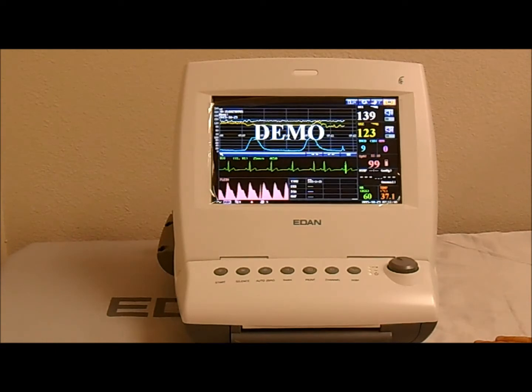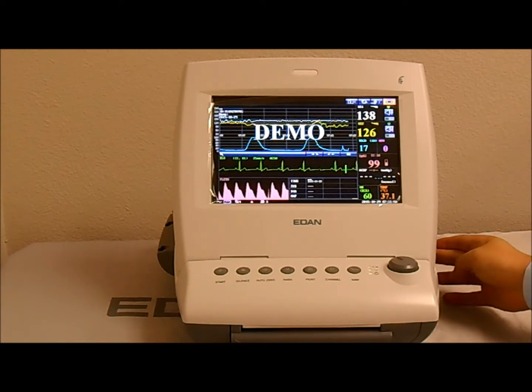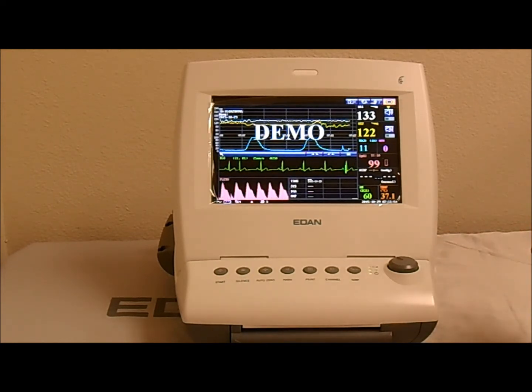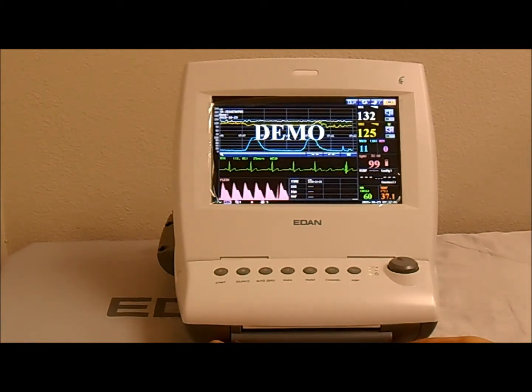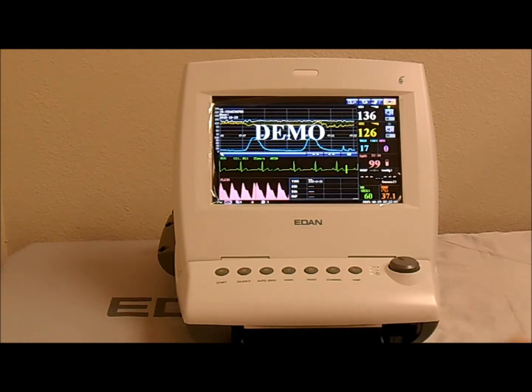Okay, now that we reviewed the different accessories and sensors that are included, let's move on to the operation of the monitor. To power the monitor on or off, you'll find there's a power switch on the right side of the case. After turning on the monitor, let's start by loading the paper. To open up the compartment, there's 2 clips on the compartment door. Press on them at the same time, and now you can prop open the compartment door.